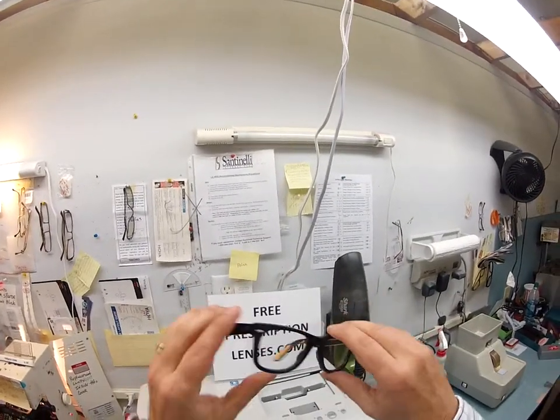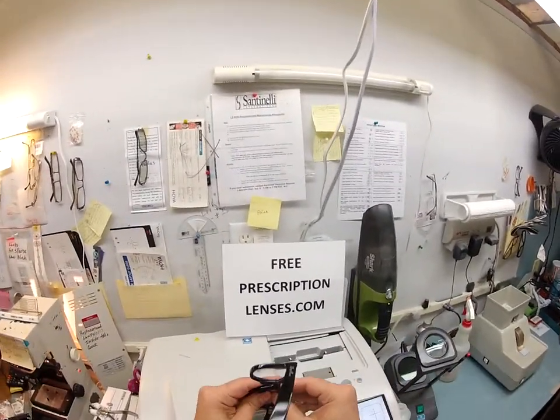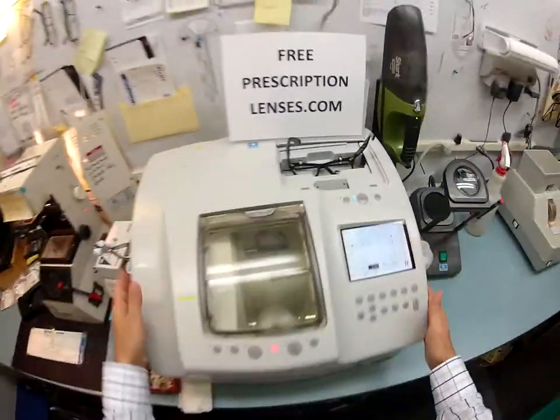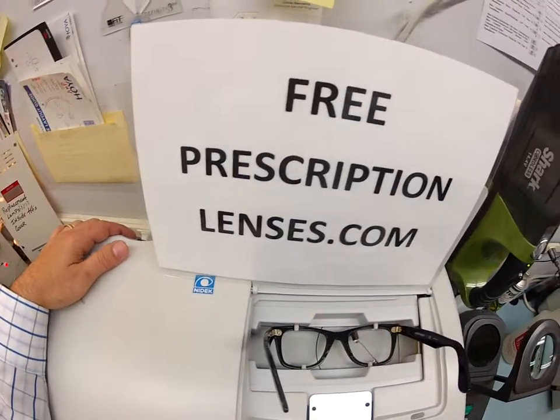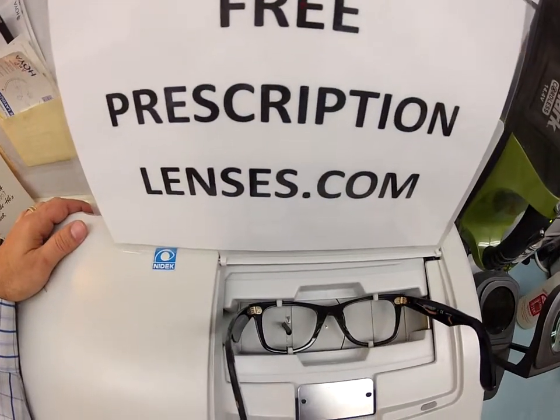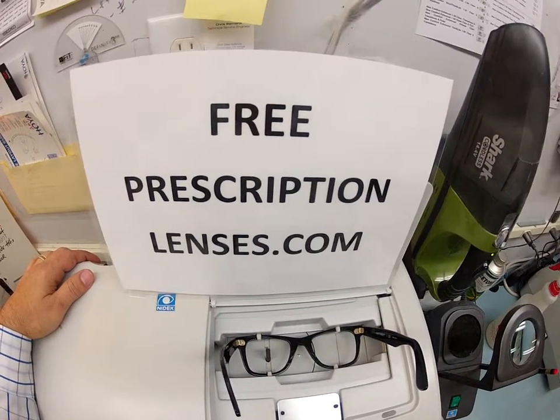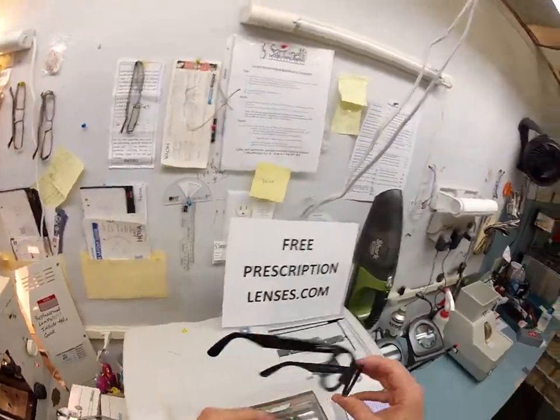That's the original lenses that come in there — Ray-Ban 5121, color 2000, size 50. The first thing I'm going to do is take out the original demo lenses because I've only got a 20-minute window. You are getting the unbreakable polycarbonate lens. They are bulletproof up to .22 caliber and have both UVA and UVB protection, as well as the transition and anti-glare lenses on top of that.